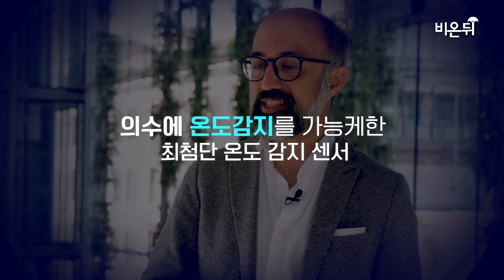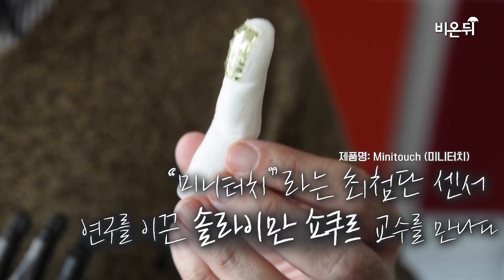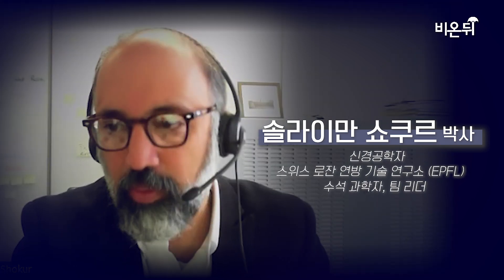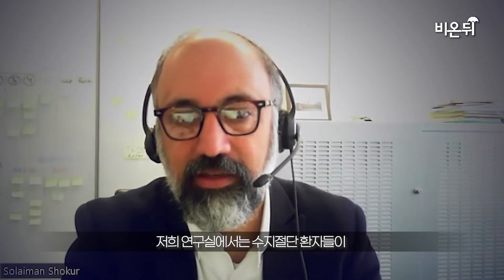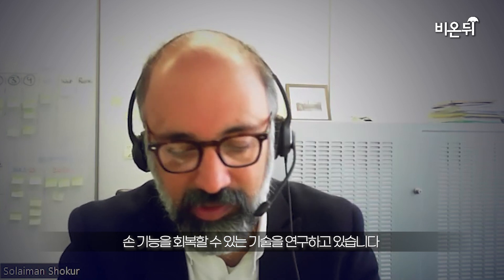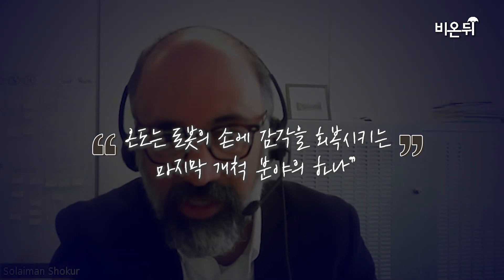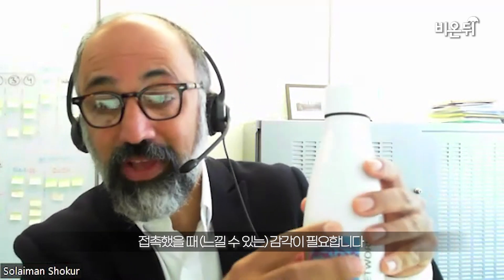This hand is the first wearable bionic hand which allows amputees to feel temperature in their phantom hands. My name is Solaiman Shokur, I am a senior scientist and lecturer at the Polytechnic of Lausanne. As a laboratory we work on techniques for amputees to recover hand functions, so we work with upper limb amputees. There is one thing that is always missing for amputees — it is sensory feedback, and sensory feedback is essential for them to recover some level of motor functions. Because if I'm trying to grasp something and I have to rely only on vision, that is going to give me very limited functionality. I need to feel when I'm touching it.